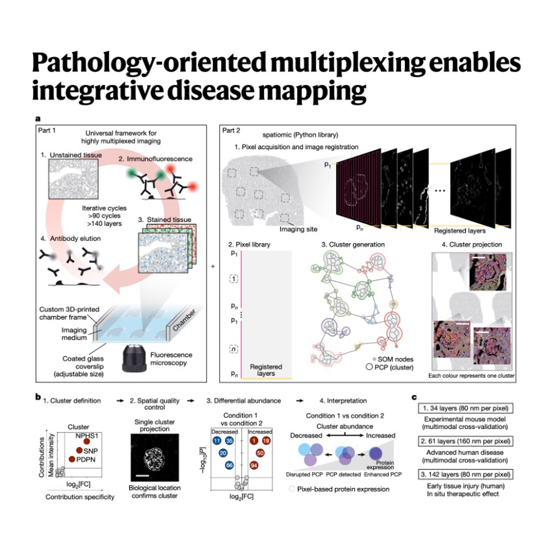Okay, what proteins define that cluster, and what does it suggest about the injury process in DKD? The main contributors to cluster 19 were 2 proteins, AIFM1 and TRPC6. Now, AIFM1 is linked to apoptosis and mitochondrial stress, while TRPC6 is a calcium channel protein. Calcium, mitochondrial stress. Where was this cluster located? Overwhelmingly in the proximal tubules. These are the workhorse cells of the kidney's filtration system.